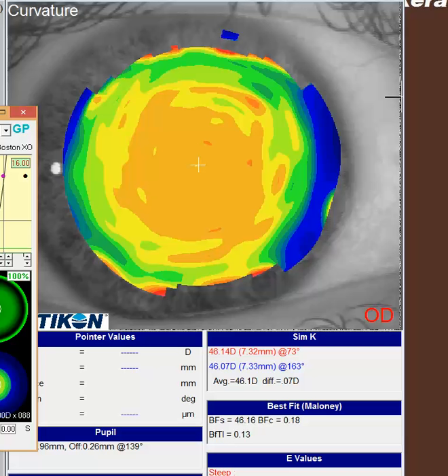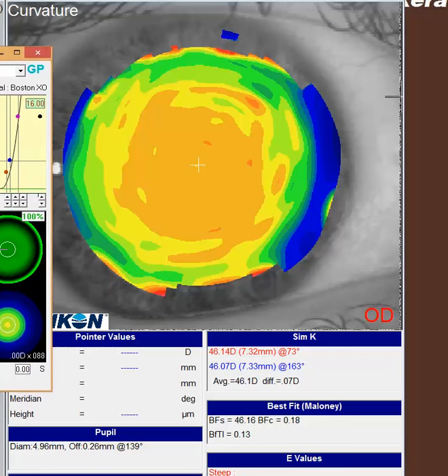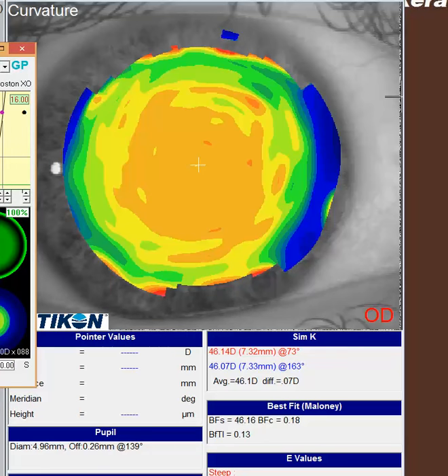And the other thought, if this individual struggles a lot with glare, you might even try some tint testing. As you know, some of those brown lenses sometimes will help cut glare and haze a little bit more from the high energy visible light out there, the blue light. If you find that somebody responds nicely to that, you may be able to get away with going with a little smaller lens around 13 to 13.5, and maybe doing a Fluoroperm 60 with a brown tint to help cut out some glare. That might cut down daytime glare if it's a person who's a little photophobic, as opposed to just sensitive to glare from a large pupil. So that's just a little side thought you can try.